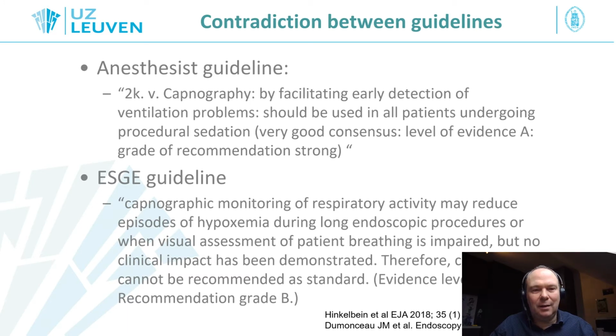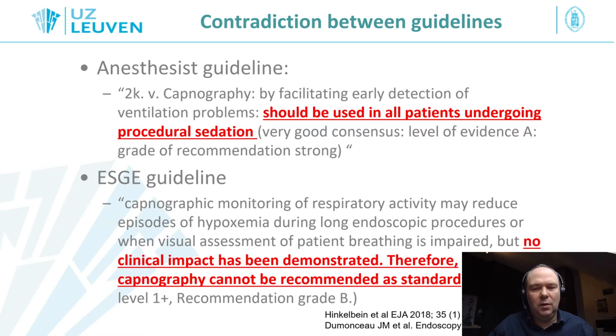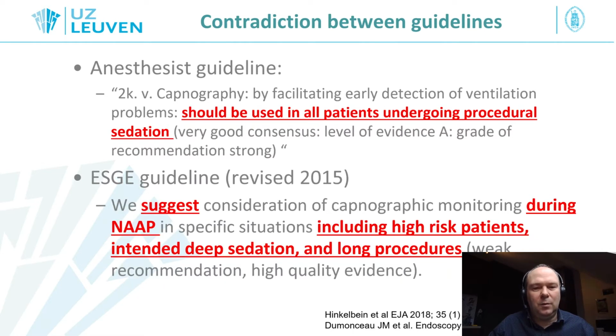If we look at the guidelines that are available, there seems to be some contradiction between the anesthetist and the endoscopy guidelines. The anesthetists strongly recommend that it should be used in all patients undergoing procedural sedation. However, in the first endoscopy guidelines from 2010, because of the limited clinical impact, it was not recommended as a standard. In the revised guideline from 2015, a suggestion is made that in high-risk patients and for deep sedation and long procedures, when non-anesthetist propofol sedation is given, it can be used.